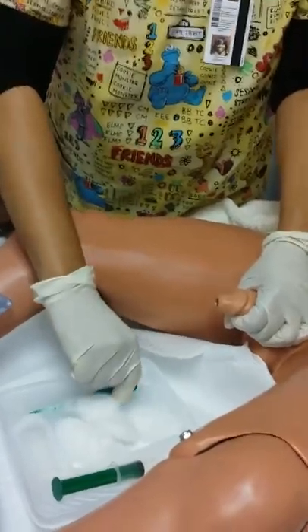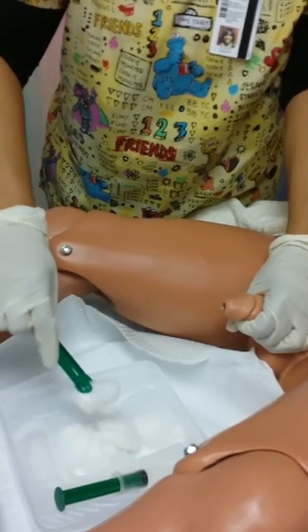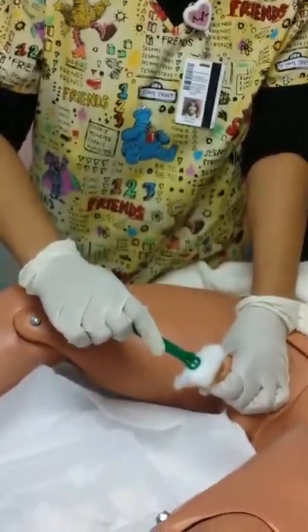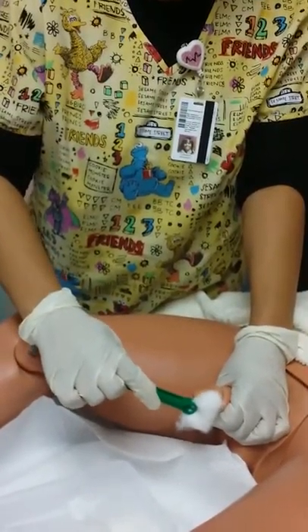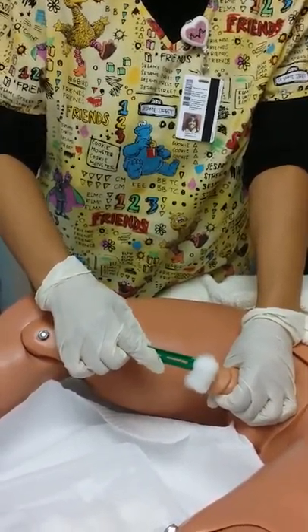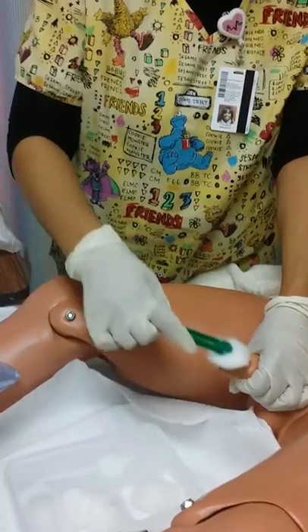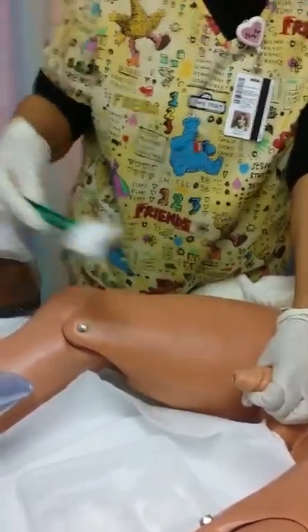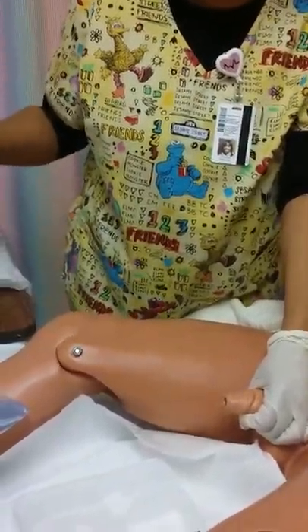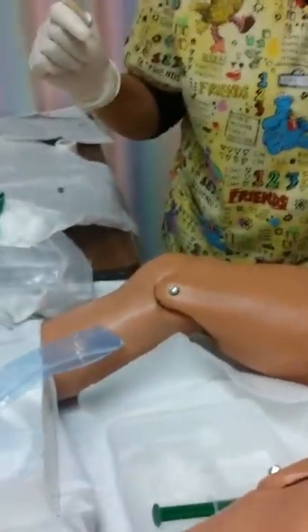And I'll go ahead and grab my prongs, and I'll grab one cotton ball. And as we said, we're going to use the same technique, circular motions, three times. Start with the head of the meatus, and then discard. One time. Two times. Discard. Three times. Discard. Okay. Discarded it. So now I'm ready for insertion.